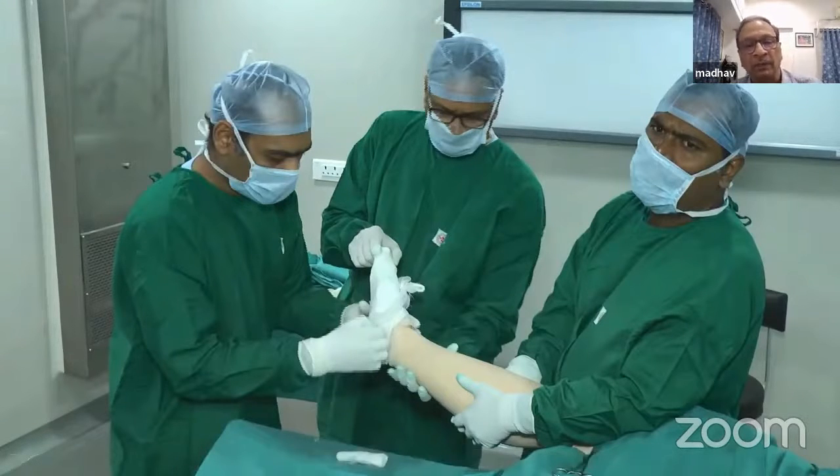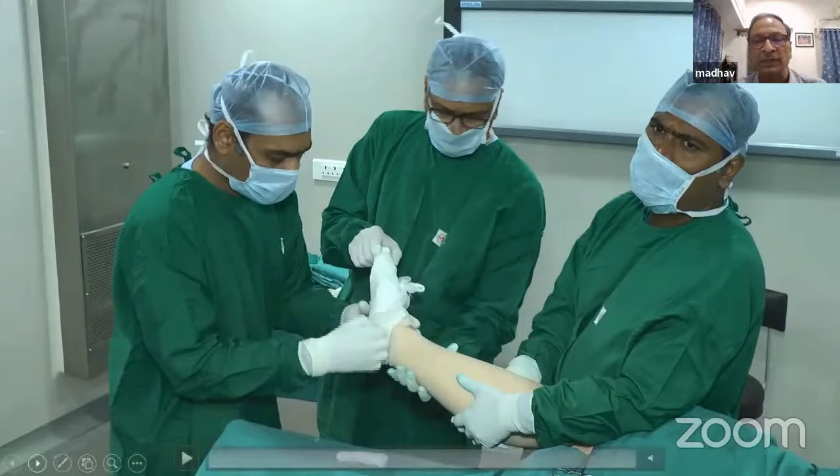If you want to operate on the heel, instead of pulling the glove over the heel, you keep the heel open and just cover the toes. So this technique applies for the leg below the knee.